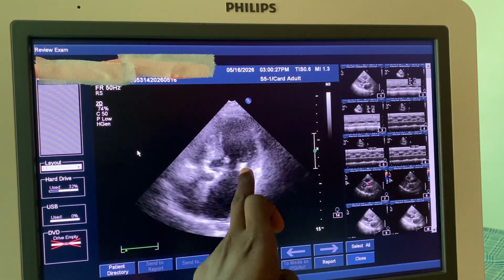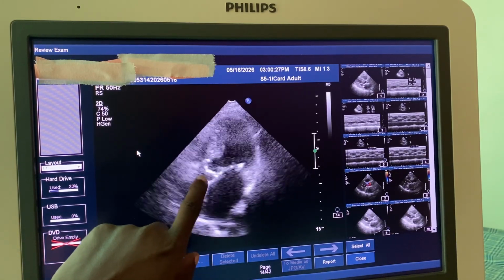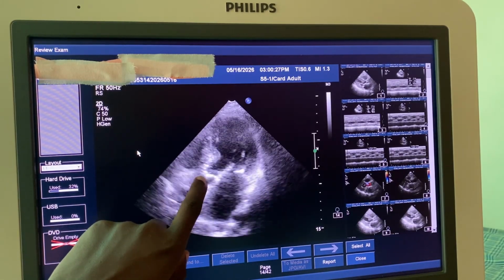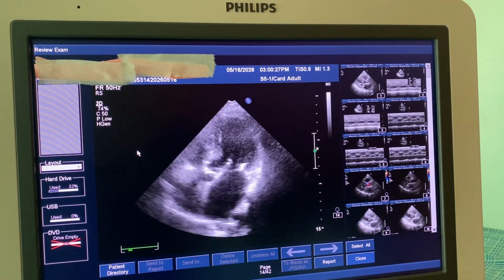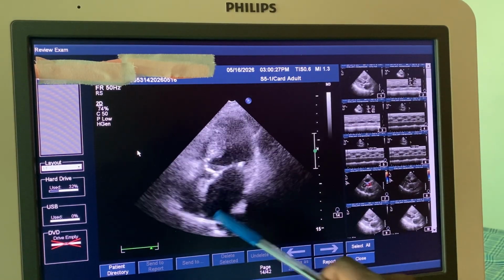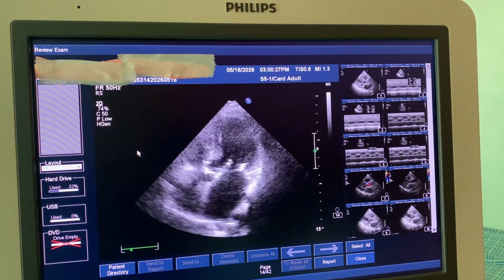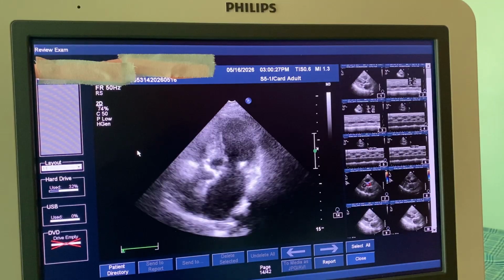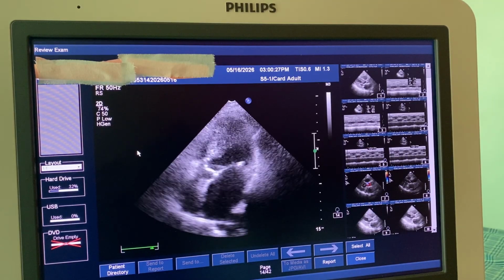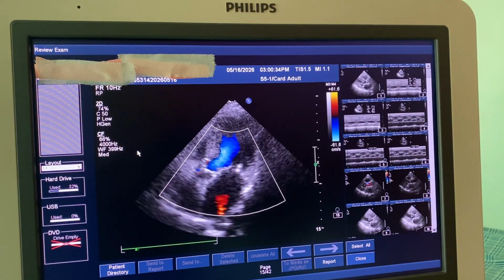And this is the mark. Calcification here. This valve, it is not opening almost. The aortic valve and all that is calcified, severely calcified. Dilatation here. Severely calcified, and the left ventricle is almost small. We said it's on the lower border, with a narrow cavity. So next, we confirm there is no regurgitation.